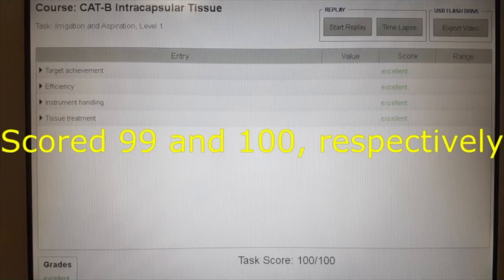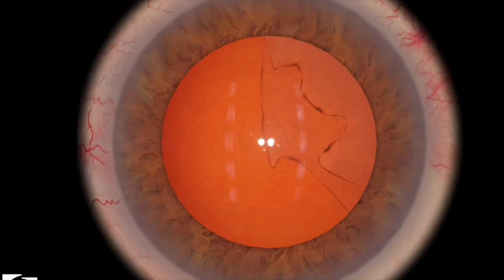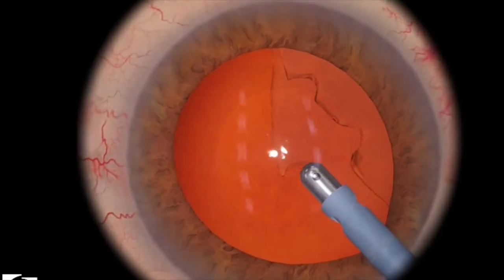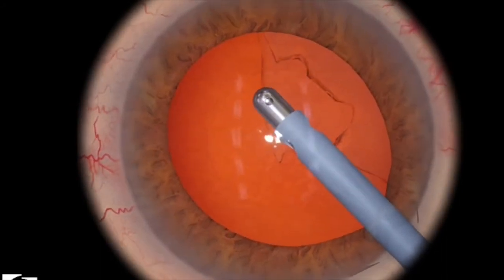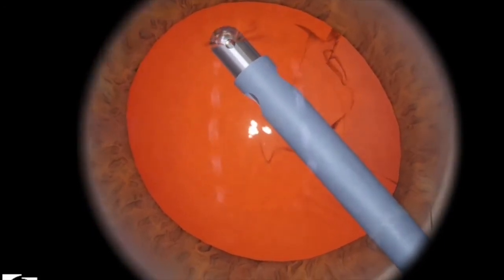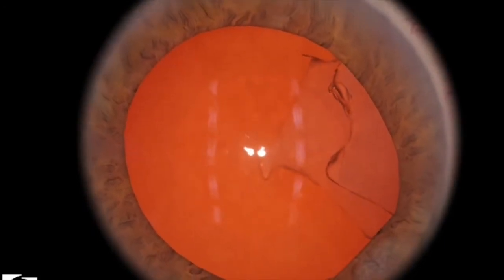I scored 99 and 100 respectively on both levels. Here's what you shouldn't do in this particular level: you shouldn't engage the anterior capsule. I'm just zooming in a little bit — there, you've engaged the anterior capsule.